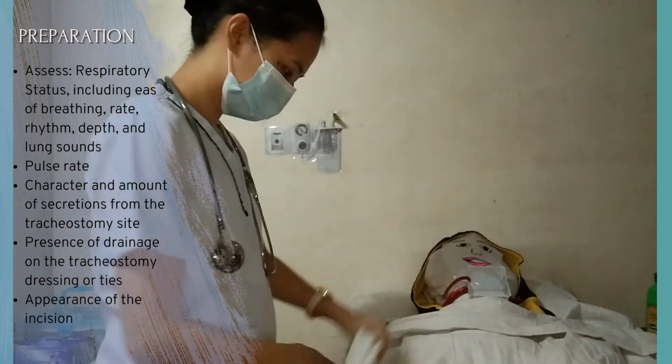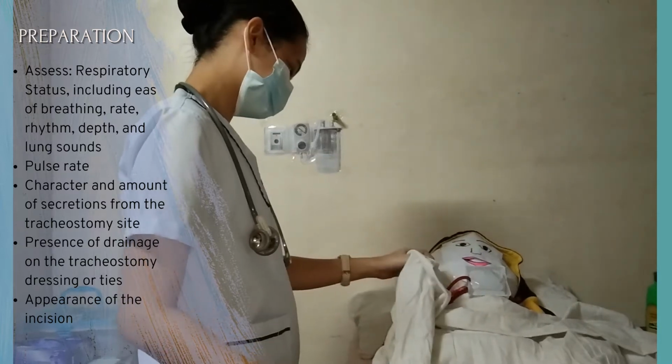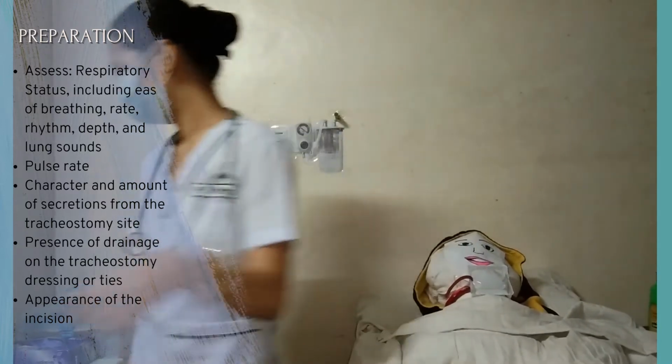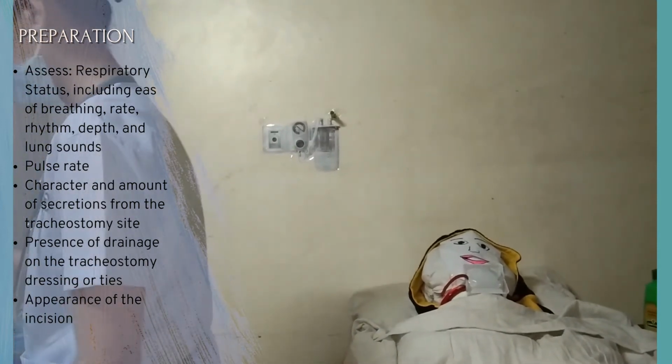Assess for the character and amount of secretions from the tracheostomy site, presence of drainage on the tracheostomy dressing or ties, and the appearance of the incision. This determines the need for suctioning and airway care management.